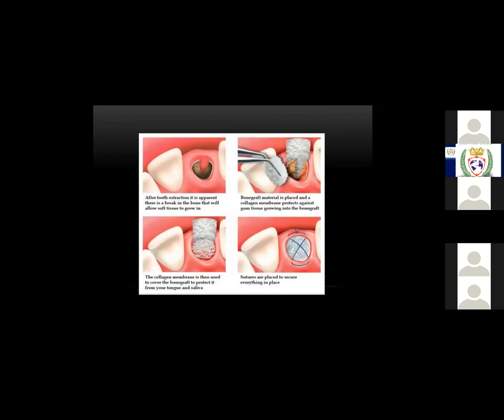Yes, zirconia crown, we can do it. Personally, I'm a big fan of PFM crowns, but zirconia crown is definitely indicated, and a lot of zirconia crowns are used now. Zirconia crowns can be used, but only if you have a zirconia abutment with the zirconia crown, the integration of the whole assembly will go well. If you have a metal or titanium abutment with the zirconia crown, there are some small shortcomings, but we can discuss this later. But yes, zirconia crowns are popularly used.